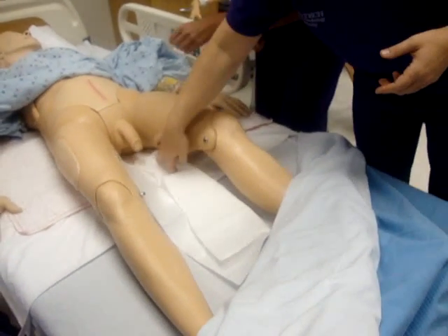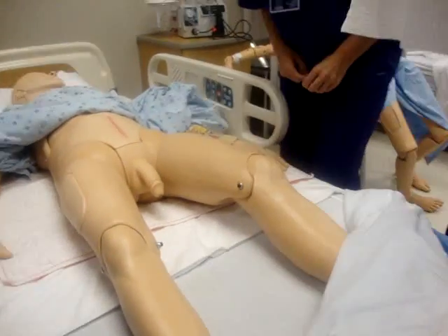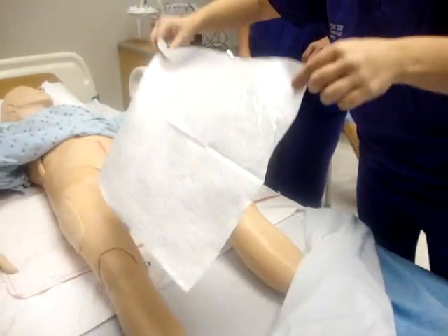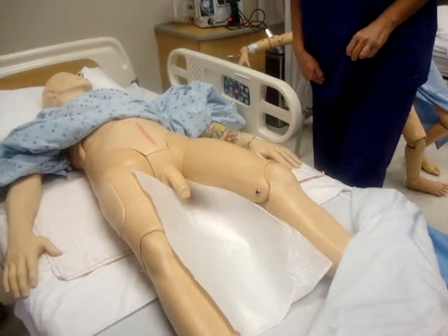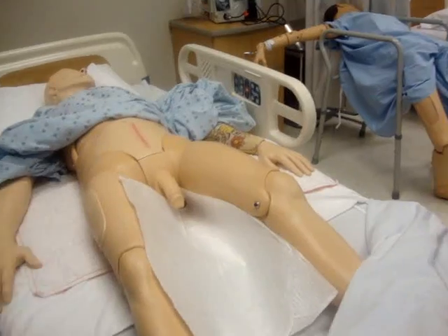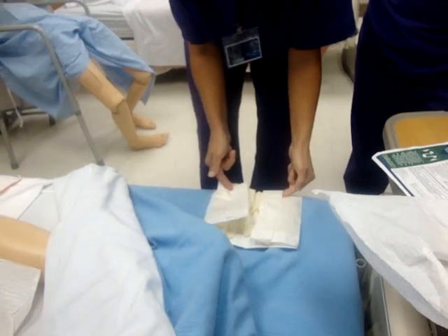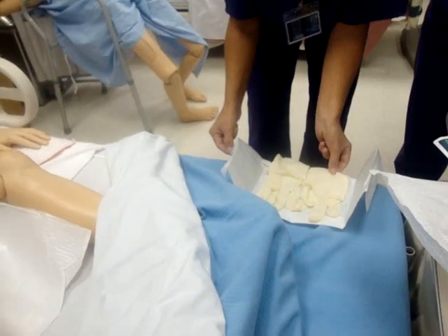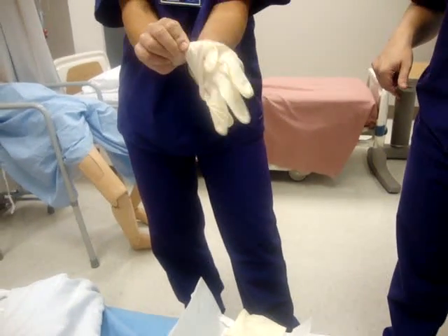Lay it down and then we have to kind of push it up under his butt. But you don't want to touch it — you just don't want to touch it off. This is sterile until you touch it; you want to keep it as clean as possible. This is just really just to catch the drips, so you can kind of do that — that's fine. It doesn't have to be pretty. Now I found my gloves.